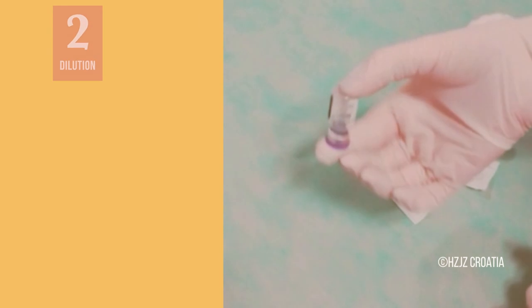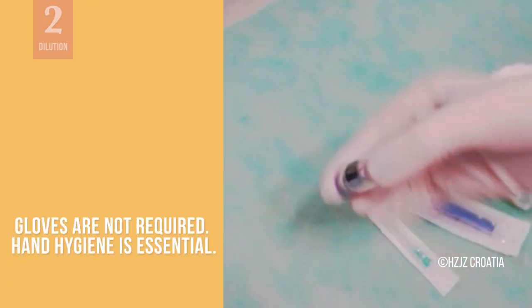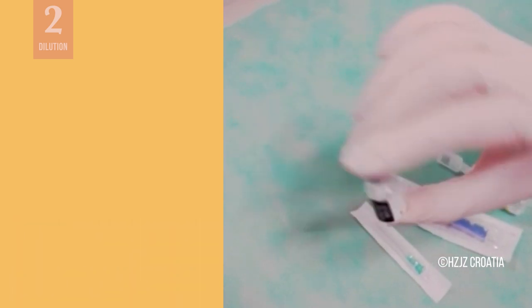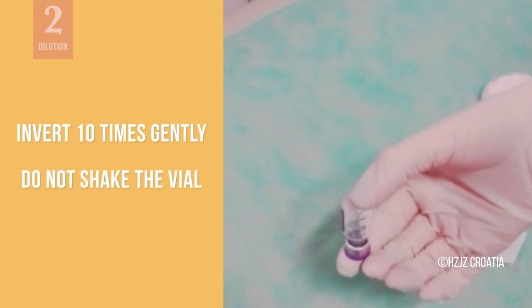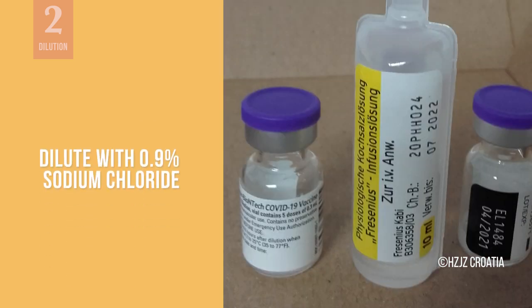When the vaccine has reached room temperature and the vial is not cold to the touch, it is ready to be diluted. First, invert the vial 10 times gently to mix it. Do not shake the vial to avoid any foaming. Next, dilute the vaccine. Using a 3 or 5 ml syringe, carefully draw up 1.8 ml of the diluent — sterile, preservative-free 0.9% sodium chloride.